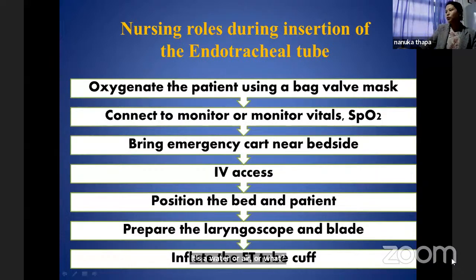Air. Yes, we have to use a syringe, and mainly we use 5 ml of air, into the ET cuff.